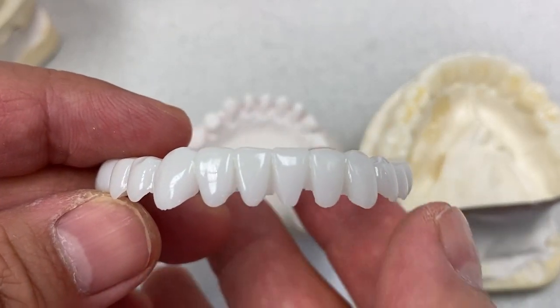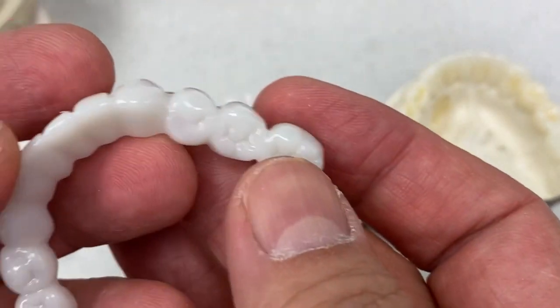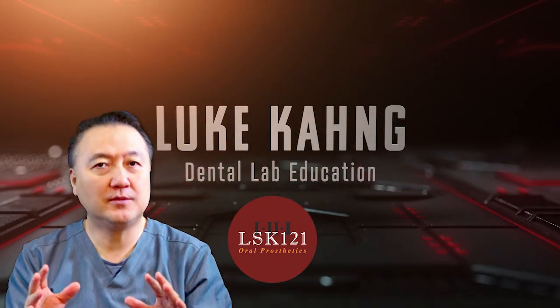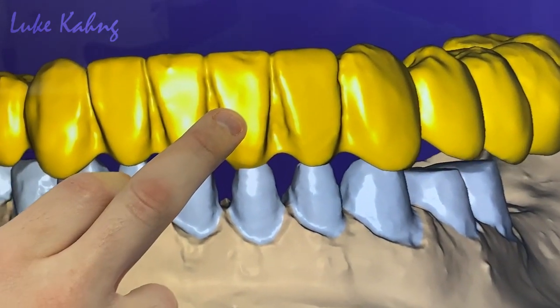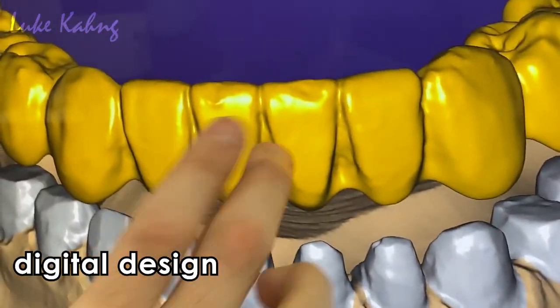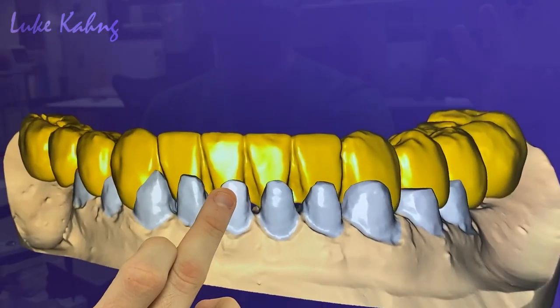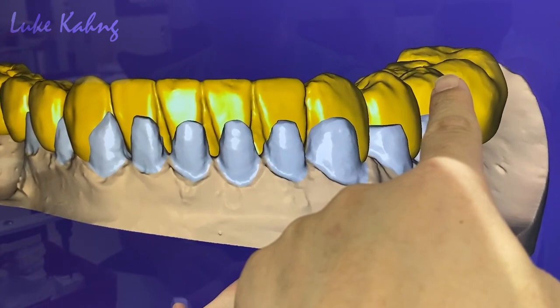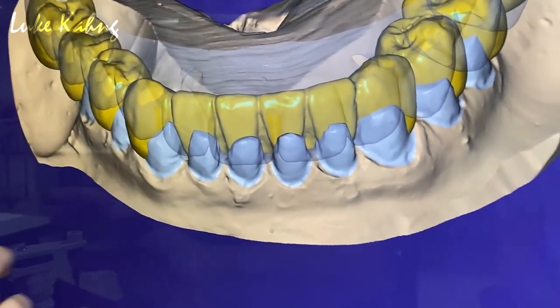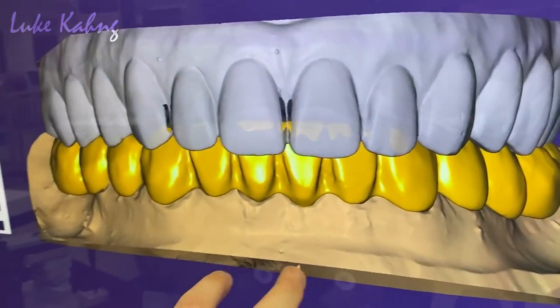This is the final lower bleaching color with a temporization. This is the wax-up, and then we prep the teeth. We're going to print it with a temporization — especially the back tooth, we grind the opposing. Check the opposing teeth, and especially the back tooth.